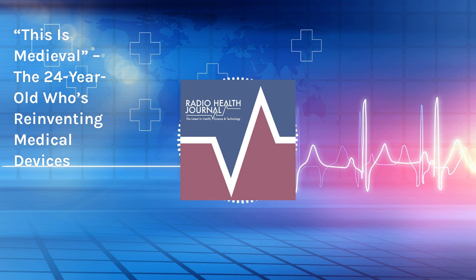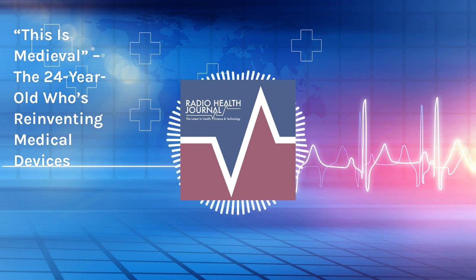Surgeons use both hands, one to hold the device in place while the other winds the crank to drill into the patient's skull. Though operating rooms are now equipped with incredible systems that can hit specific GPS points and utilize augmented reality technology, many hospitals use the manual device as an emergency bedside operation. We have high-speed drills. We have all sorts of tools that can make this faster and safer. But in the ICU, those things are typically not available.